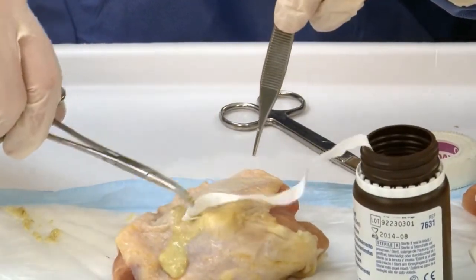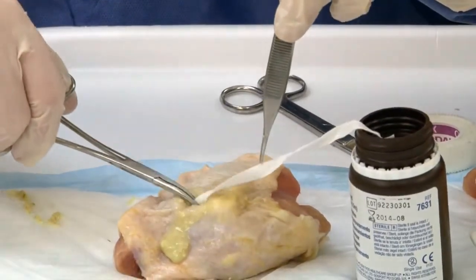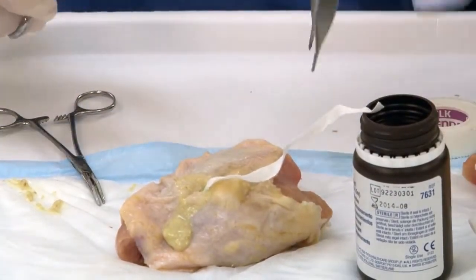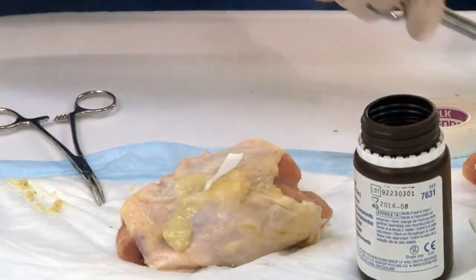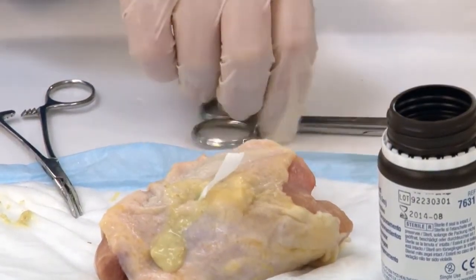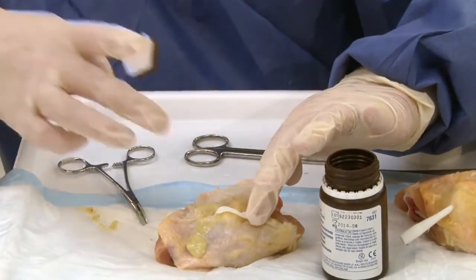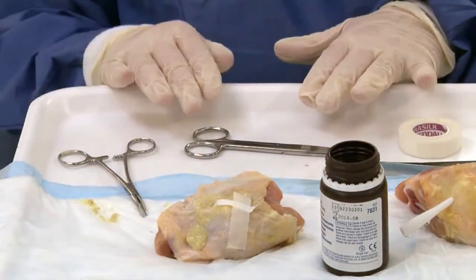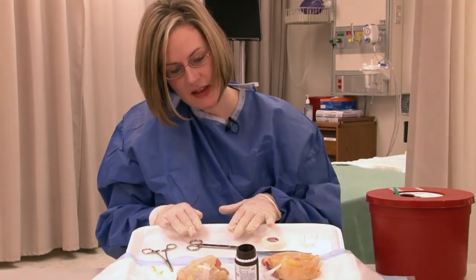This is a great way for students or practitioners to practice using packing. Then once the packing is in place, I'm going to cut it off, and then I'm going to secure it with tape. I'll do this on the outside instead of the inside of the labia minora. And this concludes the incision and drainage of a Bartholin's abscess, packing with iodoform packing.